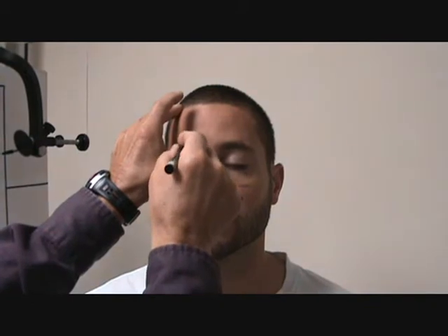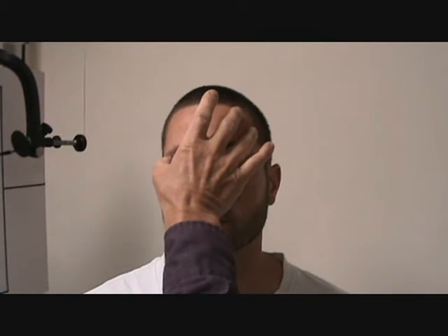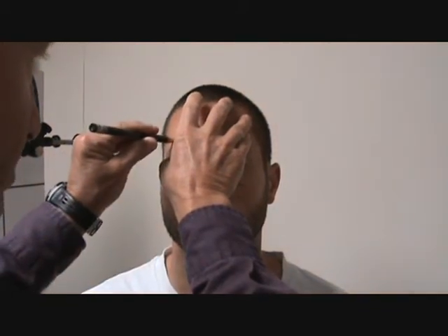In this particular case, I'm going to place the pad of my thumb toward the eyeball, wedge my thumb right in there, make sure that my thumbnail is going straight up and down, then follow straight up my thumb and mark a dot above the orbit — that's the medial aspect. I'm also going to change my thumb so the pad pushes against the eyeball, coming straight in looking at the patient, move that eyeball just a little bit, and mark straight up above my thumbnail. I've now represented the medial and lateral aspect of the orbit. I'll come straight on and mark a dot between those two — that represents the center.